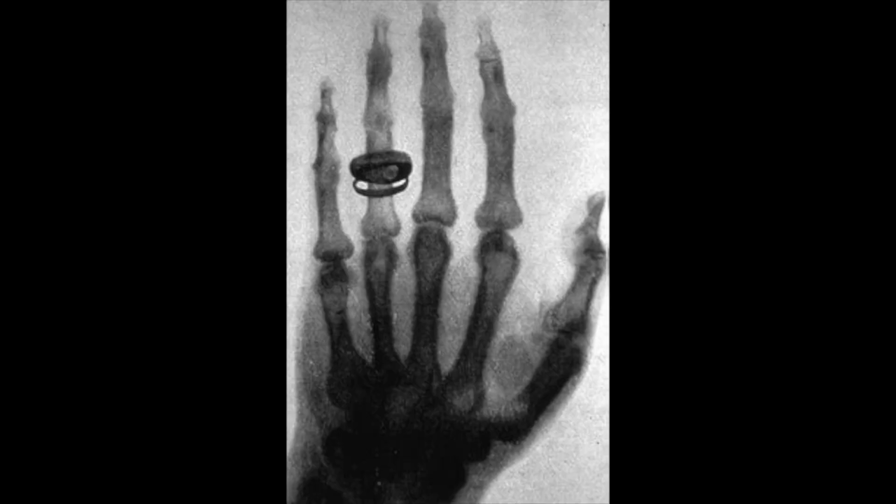Röntgen later created a higher quality image and presented his discovery to other scientists at a conference. Something you might be asking yourself about this image is why are the bones dark and the surrounding areas light? Because in X-ray images you're used to seeing, the opposite is true. The bones are light and the rest of the image is dark.